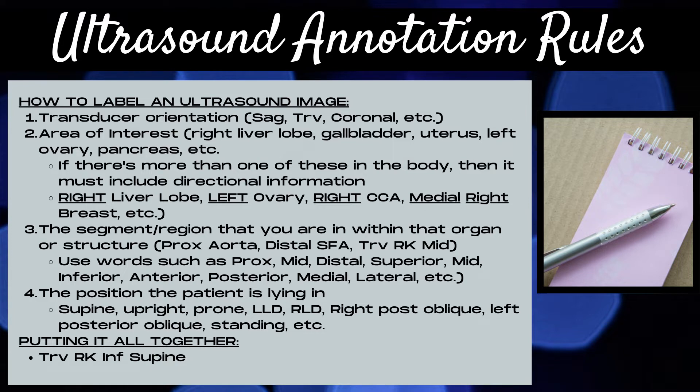You want to clearly label the area of interest that you're focusing on — whether it's the right lobe of the liver, the gallbladder, the uterus, the left ovary, or the pancreas. Your area of interest is not only the star of your image, it should also be the star of your annotation. Note that if there's more than one of your area of interest in the body, then it must include directional information.